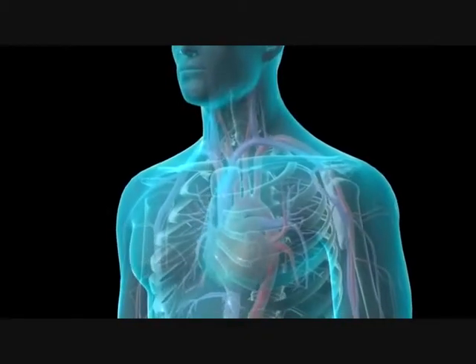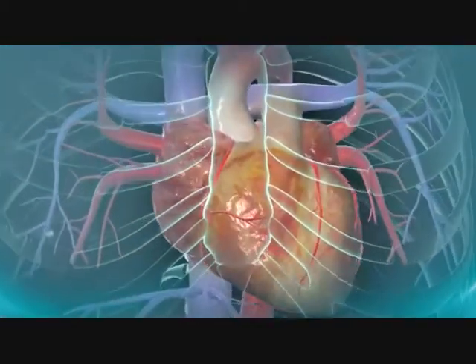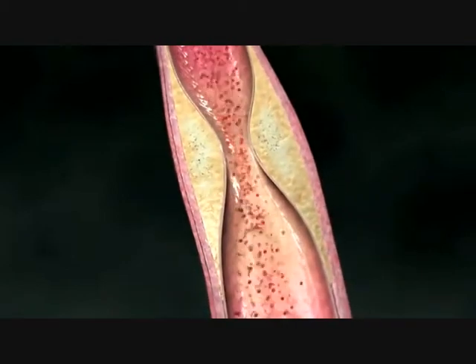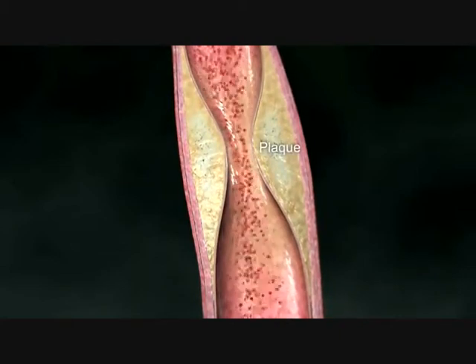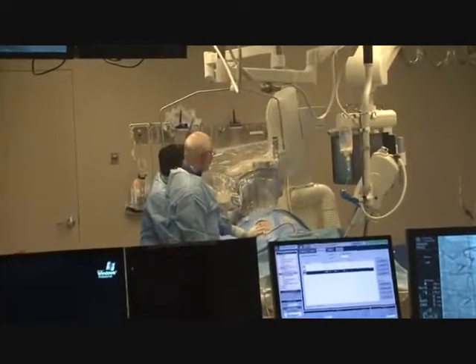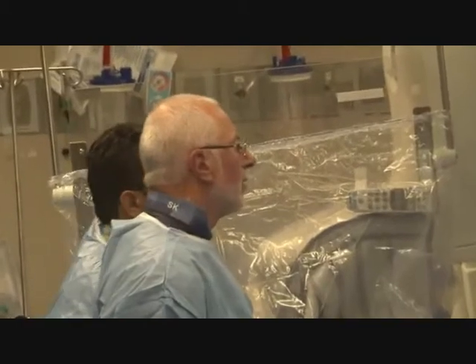Angioplasty is a non-surgical or interventional procedure for patients who suffer from a narrowing or blockage of arteries caused by the buildup of plaque that restricts the flow of blood and nutrients to the heart, a condition known as coronary artery disease. The reason a patient has a cardiac cath is because there is a suspicion of bad blockages in their arteries or a bad valve, and you need to do a diagnostic test to accurately determine what the problem is.